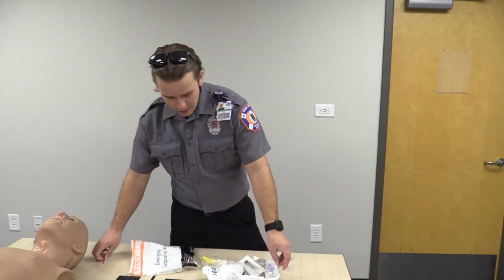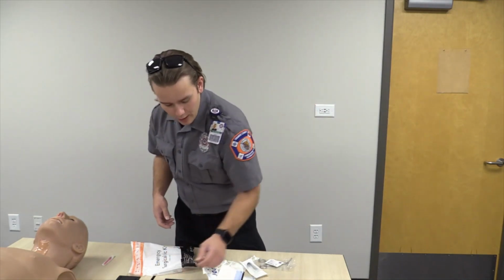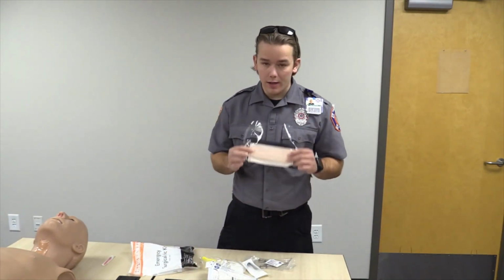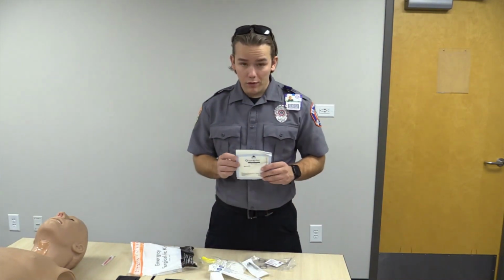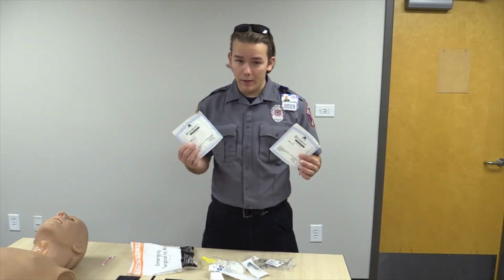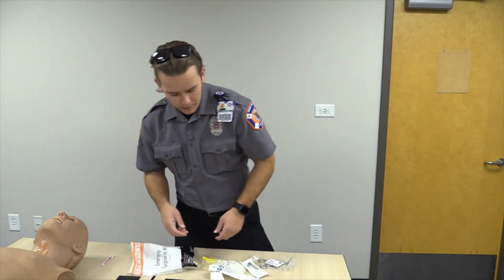First and foremost, this is going to come with a 6.5 ET tube. It comes with our mask and splash guard visor, and two 4x4s. I would recommend maybe grabbing a couple more, since this is probably going to be a little bloody, and maybe even a towel.